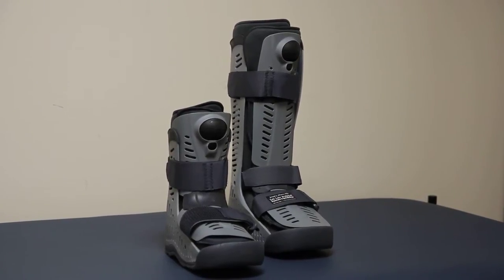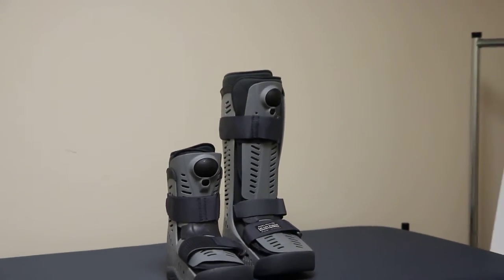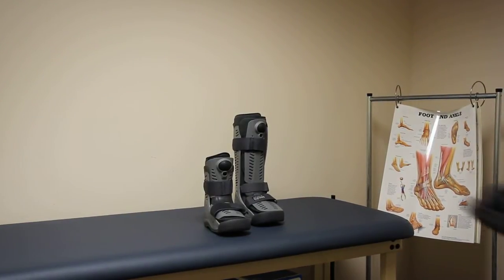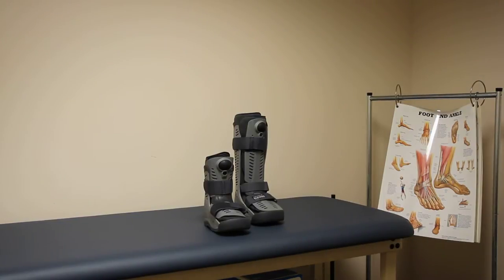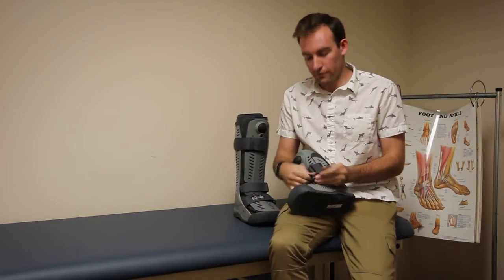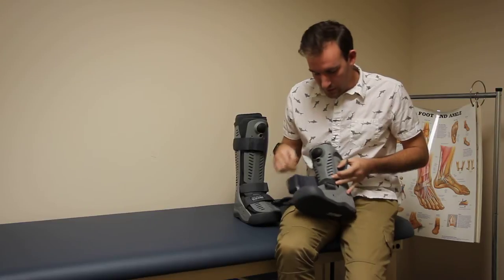Hey everyone, it's Clark from shop-orthopedics.com. What we have for you today is the Osir Rebound Air Walker. This is a very cool brace, very cool design, quite different from something like the air equalizer here, as you can see. Almost looks like a space boot, which I think is kind of neat. If you've watched our previous video about the air equalizer, it's the same concept here.